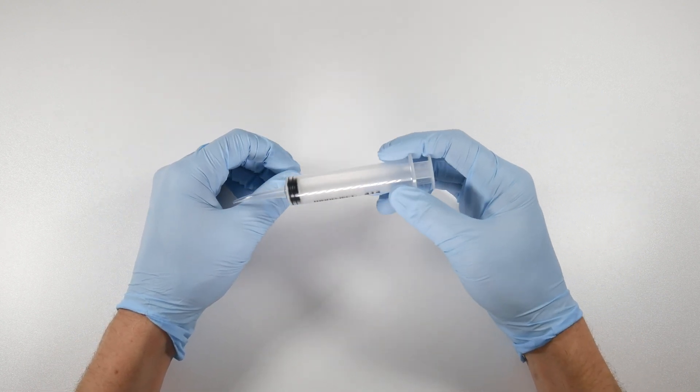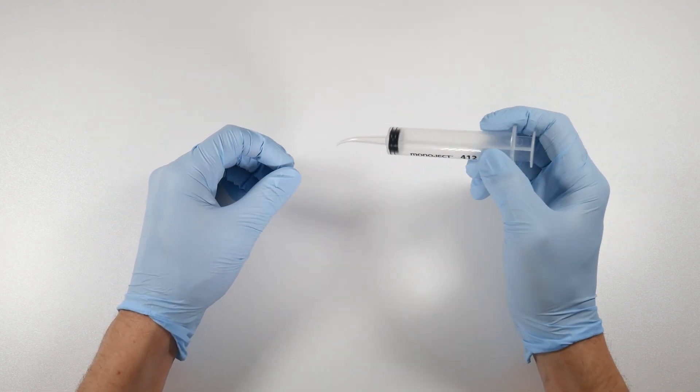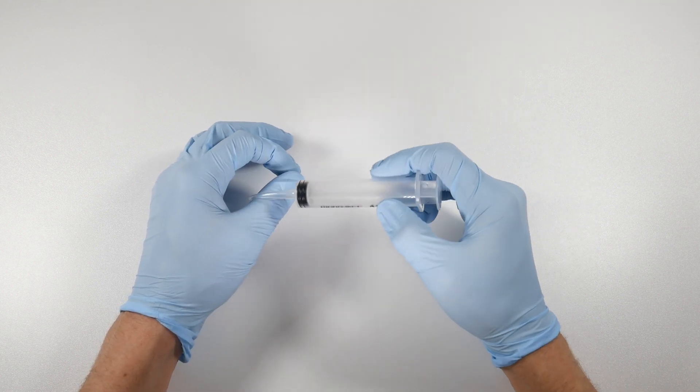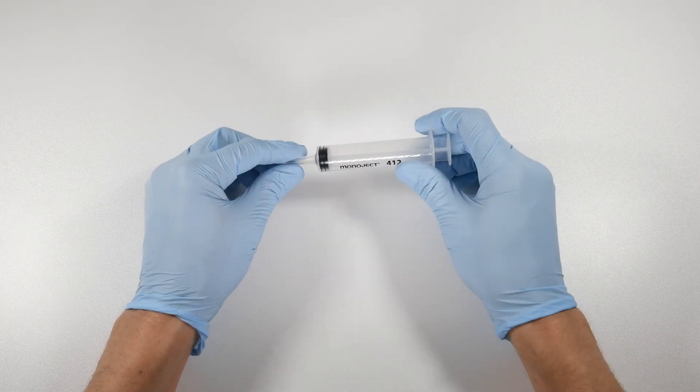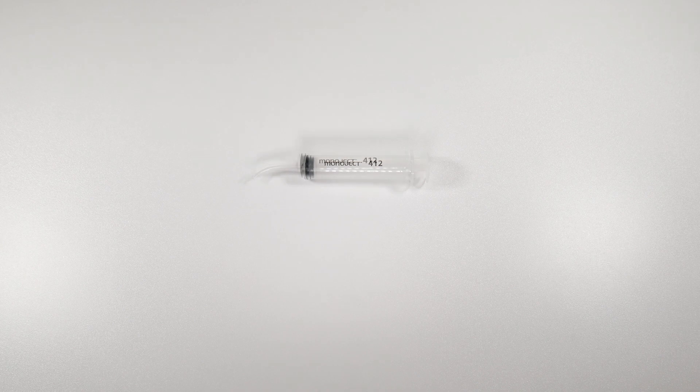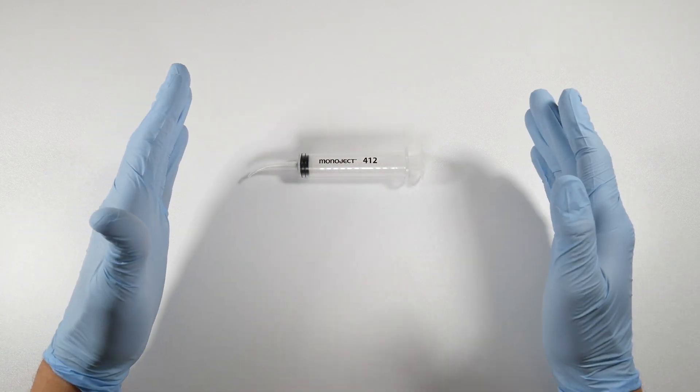Make sure to direct them to stay out of there once you do your initial irrigation. They clean up around there real quick with the suction and then don't re-enter that socket. Just leave it to get the clot forming—you're going to get better results with healing, fewer post-operative complications.